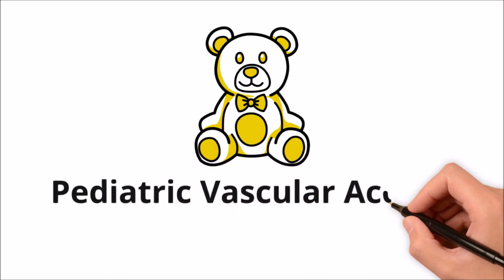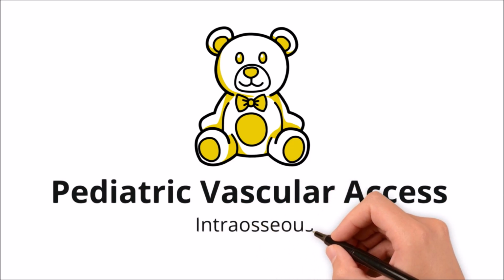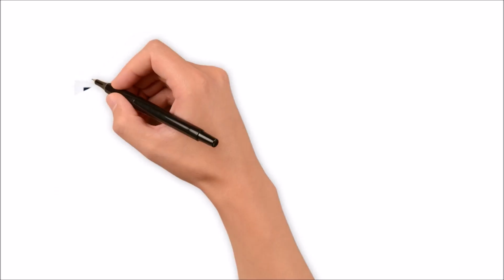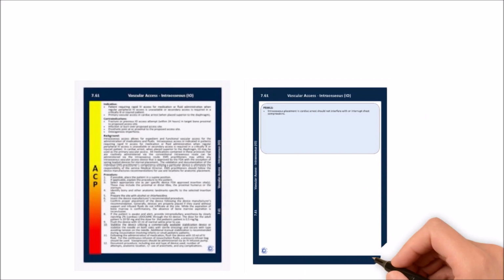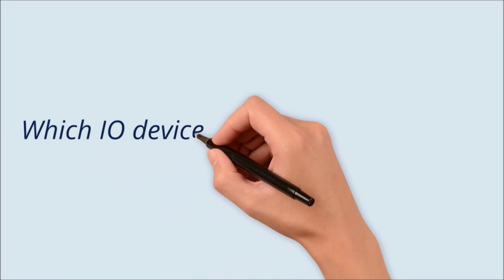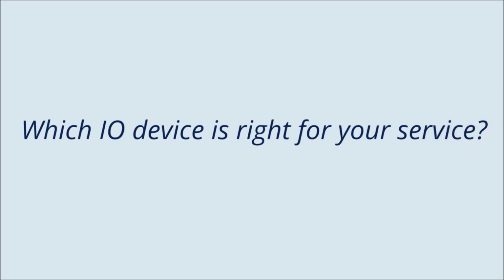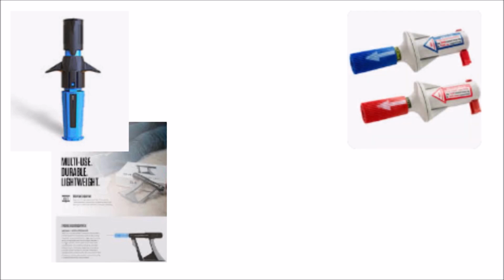Hello and welcome to this segment of Pediatric Vascular Access, Intraosseous Needle Placement. Guidance regarding vascular access via the intraosseous route can be found in Rhode Island Statewide EMS Protocol 7.61, Vascular Access, Intraosseous IO. Different services may utilize different brands of intraosseous devices. So which device is the right one for your service? Your choices will span from spring-loaded to manual drill, and the driver.